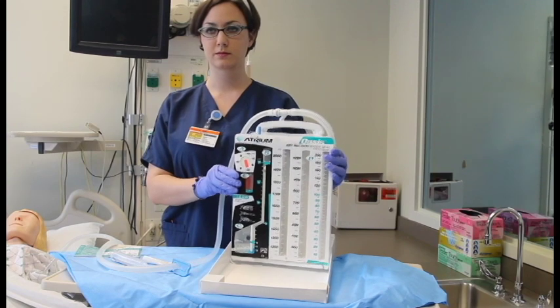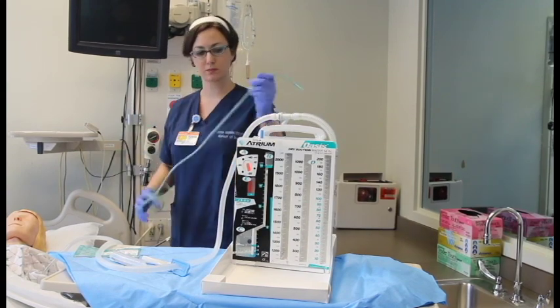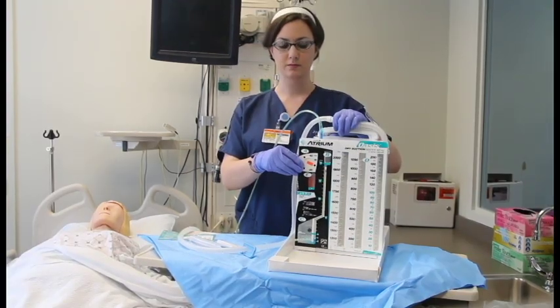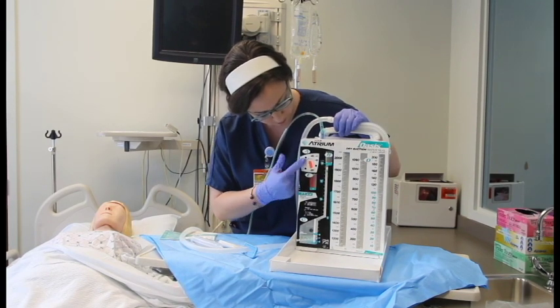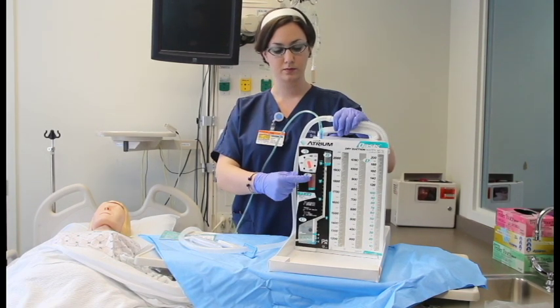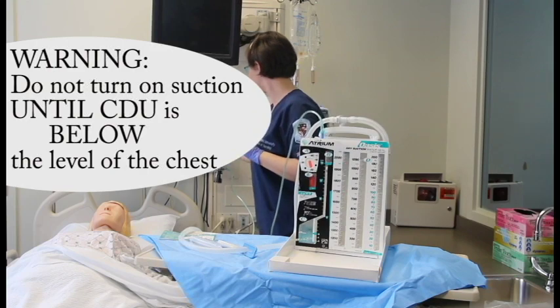Now connect the suction source to the suction port. Set your suction control per your orders by rotating the dial until the red stripe appears in the window at the prescribed level, and it may click into place. Increase your suction source until the orange float appears in the suction control indicator window.